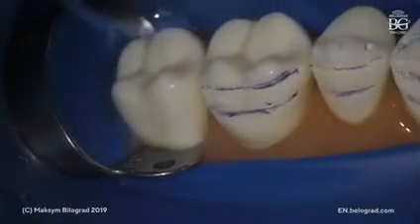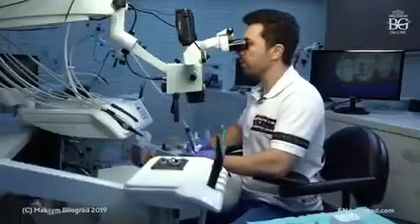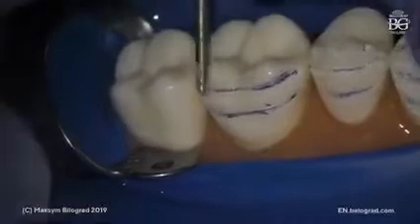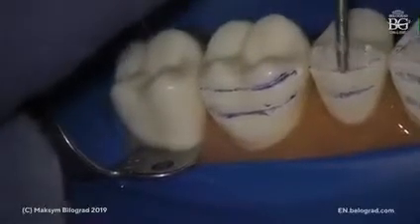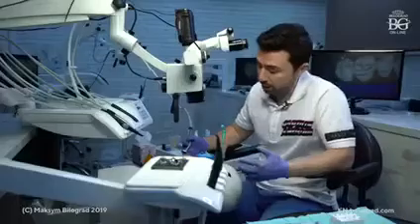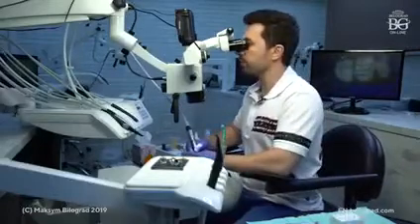So I'm having my depth cutting burr. Sorry, another burr, the tapered one. This one. This is blue stripe burr or the green stripe burr, and we can join now these grooves. For window prep and for partial reduction prep, we keep 3 planes. In keeping 3 planes, we can be really conservative because we will preserve a lot of enamel. Okay, so let me just start my preparation.